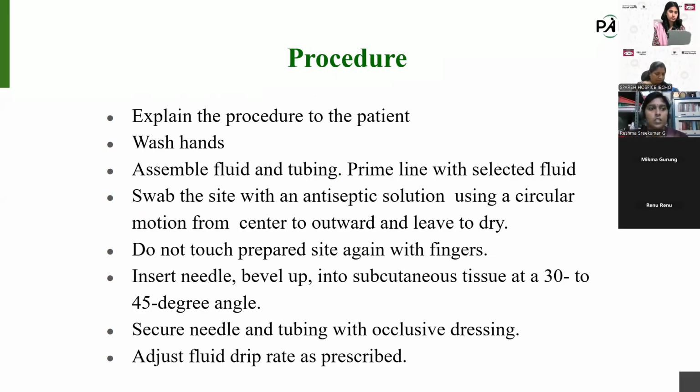I think the procedure is clear right now. This is the procedure for infusing subcutaneous infusions. The procedure is the same as for injections also. If we need to give sedation and all, we can connect the syringe pump or driver subcutaneously for that.